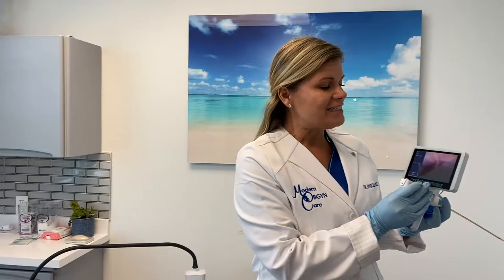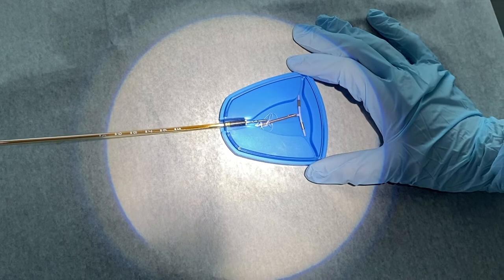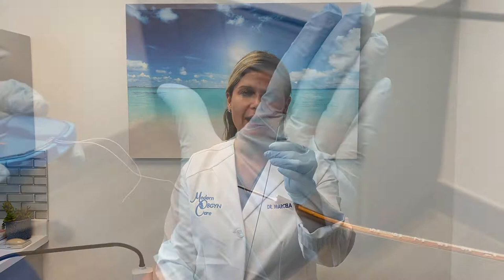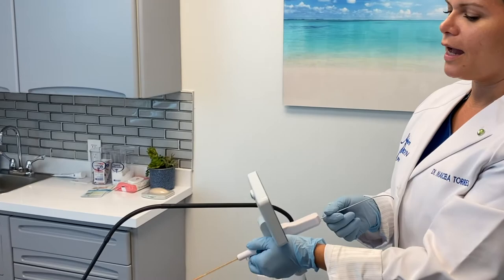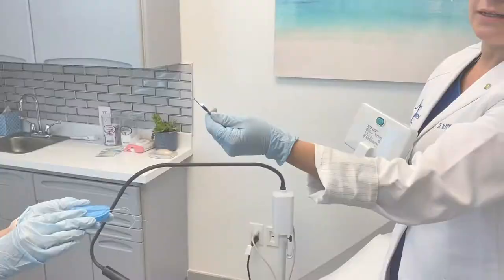The Endosee is a device that has a camera and can be used easily in the office, where we can thread the device into the cervix and see everything that's happening inside, find that IUD that's been retained, and pull it out. So the way we pull an IUD out is with this small alligator clamp. It's very small, so it doesn't hurt. It is inserted through the device into the uterus, and you're gonna find the tip coming out at the end.